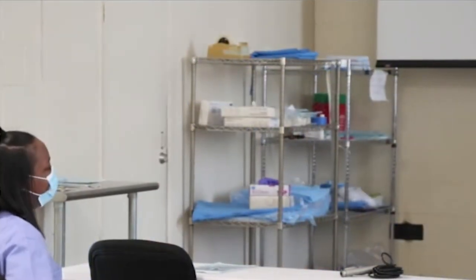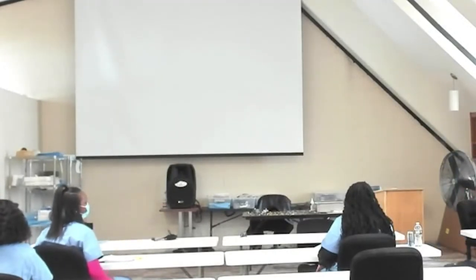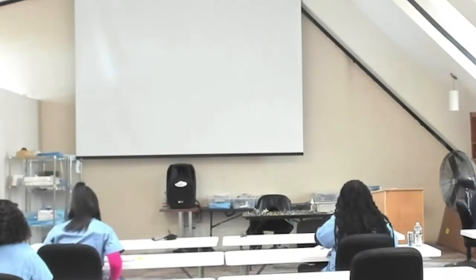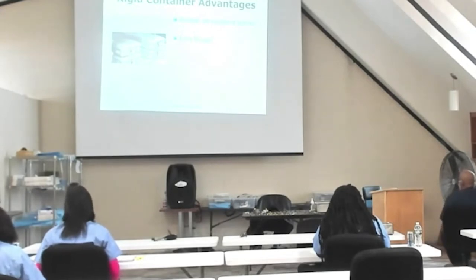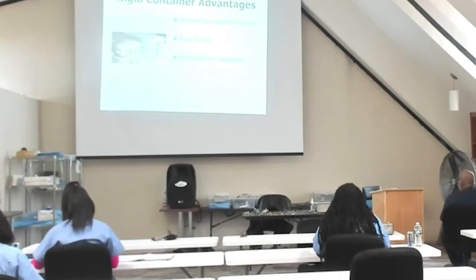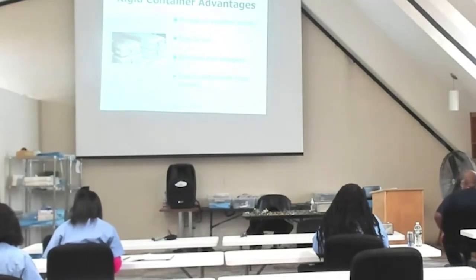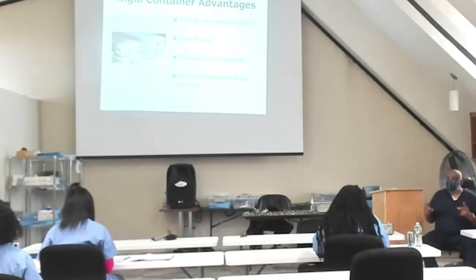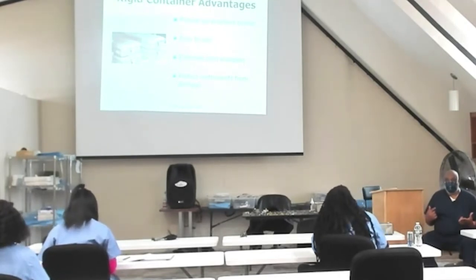So we have these rigid containers that we've been assembling our trays in. Let's look a little more at how they work for us and why we like them. One of the things that we love about them is they provide an excellent barrier against contaminants, okay? Another thing about them, they protect the instruments from damage. I have a question. So a tray comes in and it weighs 35 pounds. Can I process it? It can't be over 25 pounds.